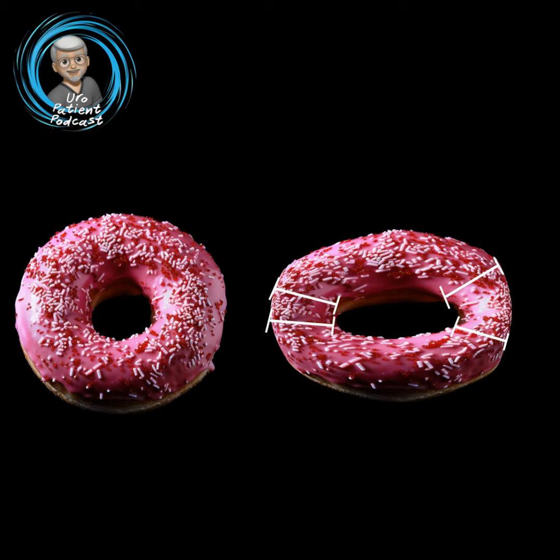I do assist with these procedures, so I'm very familiar with the UroLift. The animations always make it look a lot better, but the actual time to put each one of those little clips in is probably about 30 seconds. Those 4 steps that it takes to get those to seat in is really pretty quick. Again, how many are done depends on how big your prostate is. It's a decision how well it opens up as you start putting them in. So you want to make sure you get enough in there to really get a good opening. I've seen as little as 4 used and probably as many as about 8 used sometimes. But again, it's pretty quick to place each one.